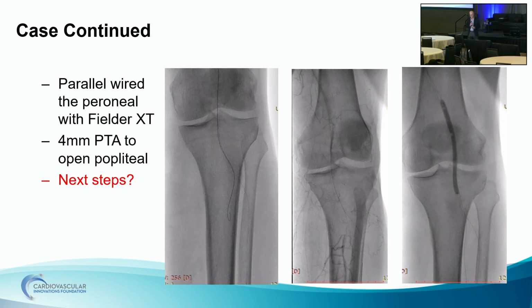I think you need an angiogram to tell you that next step. And this is one time I go a little more conservative with the first balloon. And that second wire looks like it's getting resistance right there. Is it? Or is it just the one in the peroneal? I think right before it knuckled maybe. I don't think there was any issue with the peroneal.